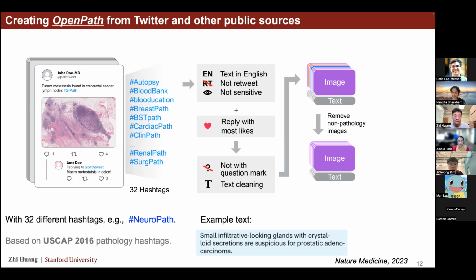Different from radiology images, pathology images are gigapixel images, right? As we mentioned, the magnification is really, really important. If you train a machine learning classifier on 20x magnification, you will see really bad performance when you apply it to 40x, because all the cell sizes will become double, out of your training distribution.